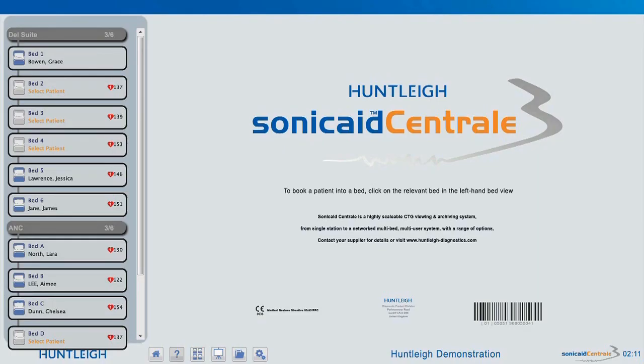This has been a brief overview of SonicAid Central, showing some of the commonly used functions and software options, making it suited to a multi-user, multi-ward environment, with a range of flexible and valuable software options, with all user actions auditable and many options configurable.